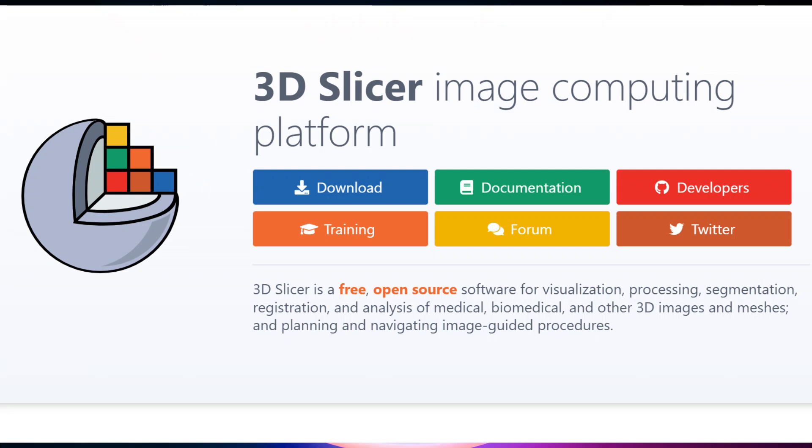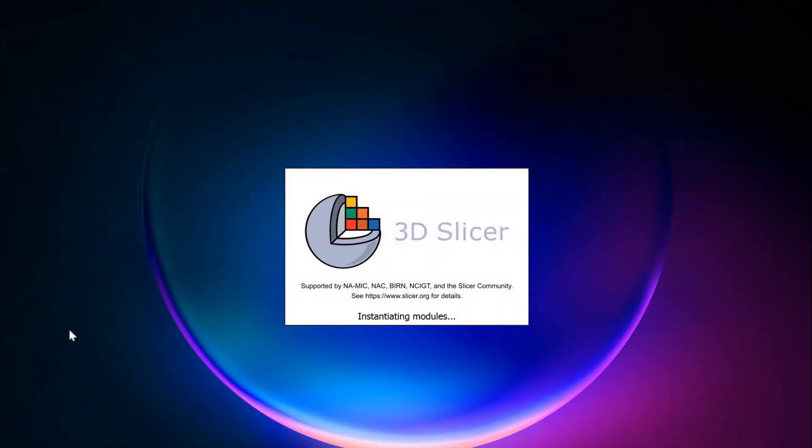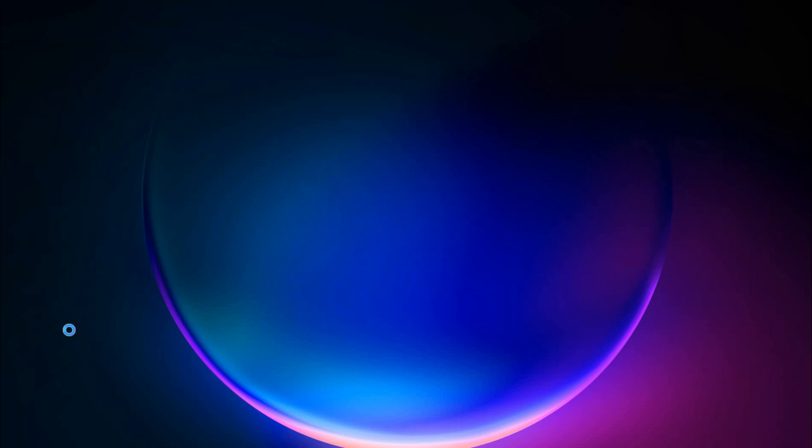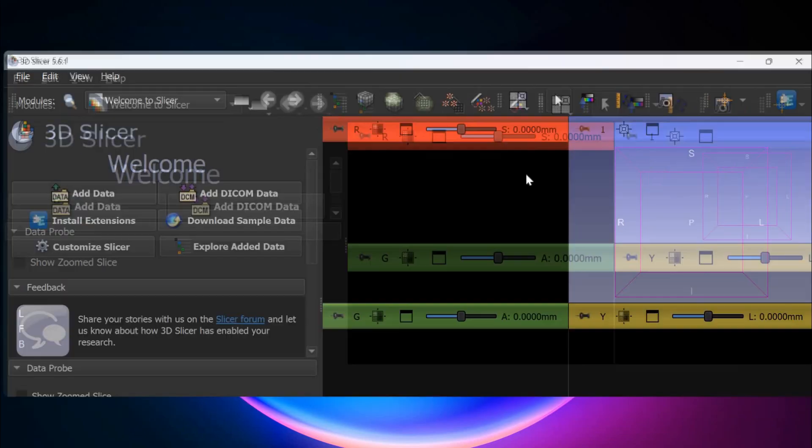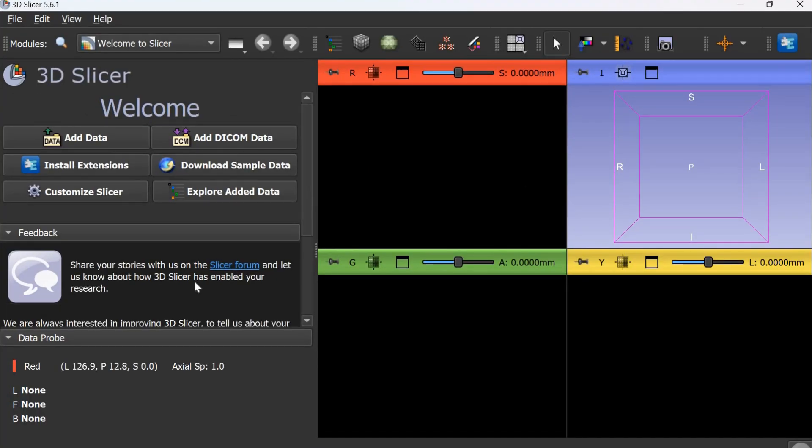3D Slicer is a free open source software which can be used for viewing medical images and creating ground truth masks. When you start 3D Slicer, the first screen is the welcome screen.